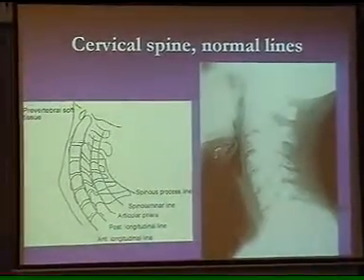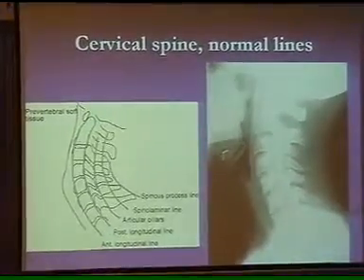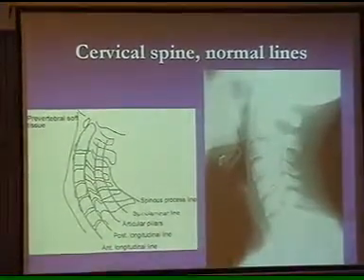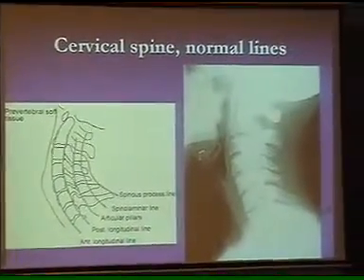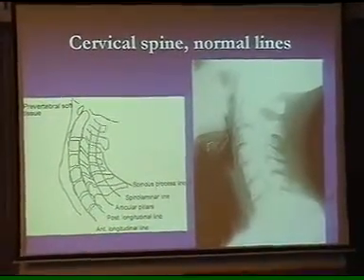Similarly, for the spine, the most important X-ray from the practice point of view is if there is any history of trauma. Once you are suspecting any history of trauma or pain in the neck, you most commonly ask for the lateral spine. We do ask for the AP view as well to look at the intervertebral disc space, especially for pain in the shoulder or arms with reference to the cervical rib. But once you are looking at the lateral view, a very important point is the certain lines which have to be carefully read out. If you appreciate these lines in every X-ray as a routine habit, let me assure you, you can pick up most of the pathologies.